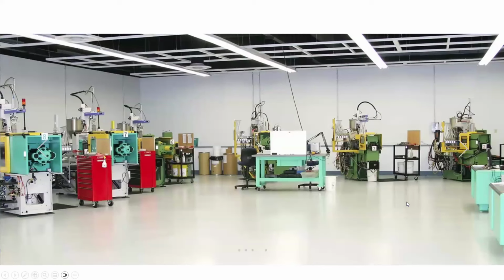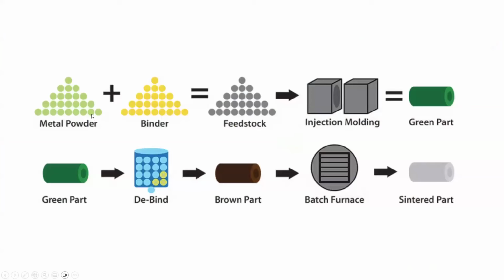We don't have to worry about tariffs. We don't have to worry about shipping out of foreign country issues, none of that. It's all here locally made, and they hold the bar high. This metal injection molding process, it's not easy.